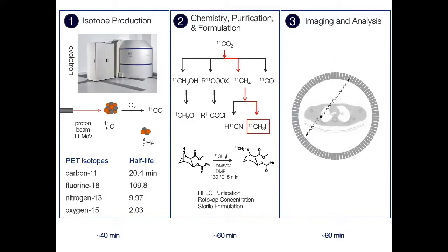radiotracer to be produced. And so if you have a scan scheduled at 3 p.m. in the afternoon, the radiochemistry team will start working at maybe noon to get your radiotracer going, so that you can have the radiotracer injected at the proper time. So timing is really, really important in PET imaging.